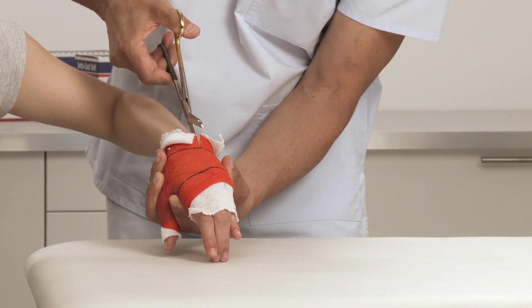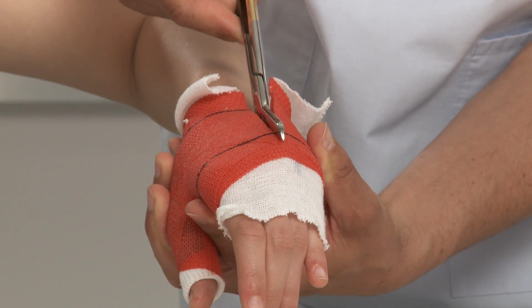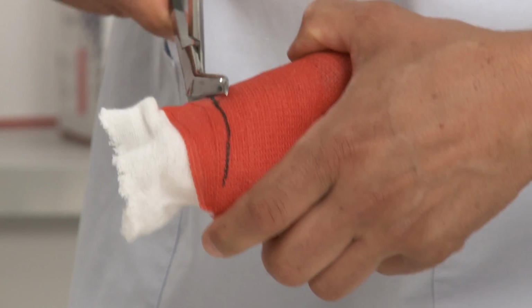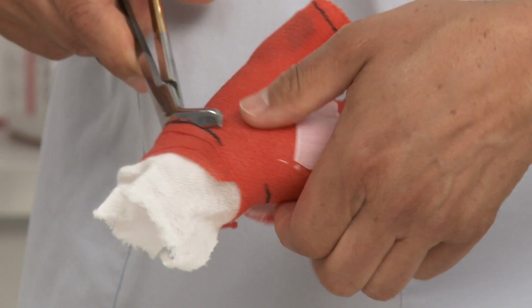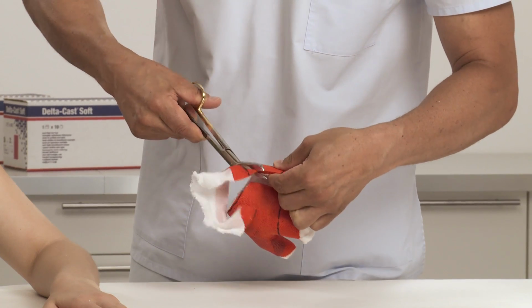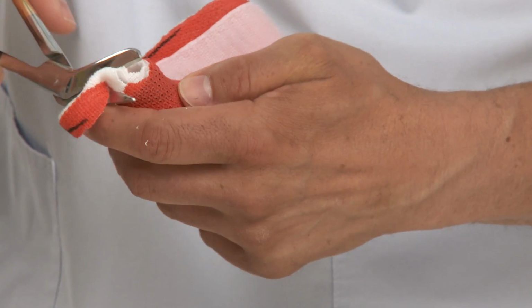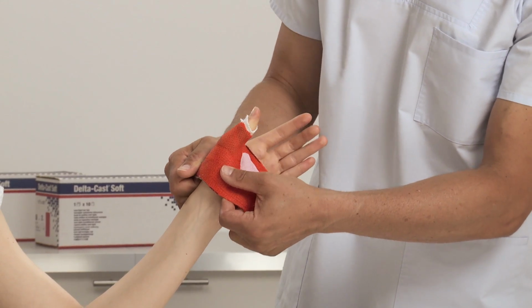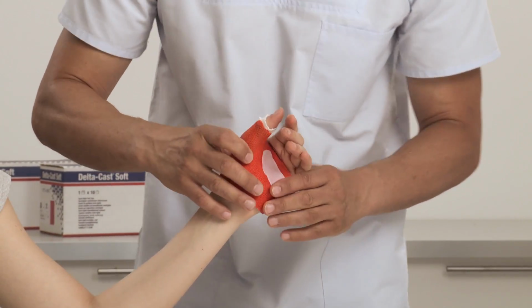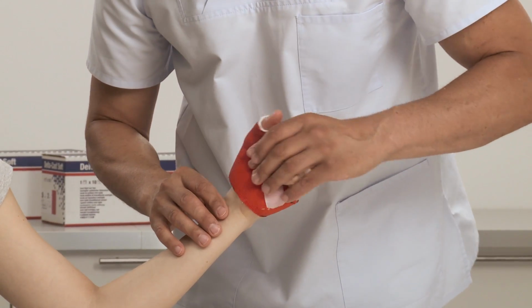Cut and remove the cast. Trim borders of cast for a good fit. Place Spica cast on patient and conduct fit test for patient comfort to see if more trimming is required and check for allowed motion.